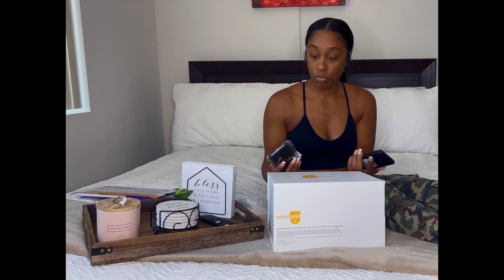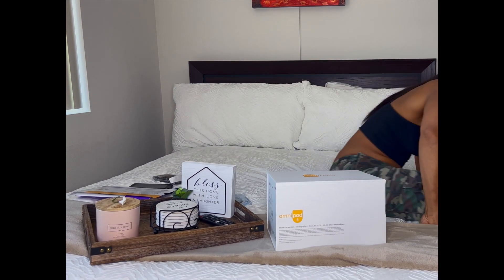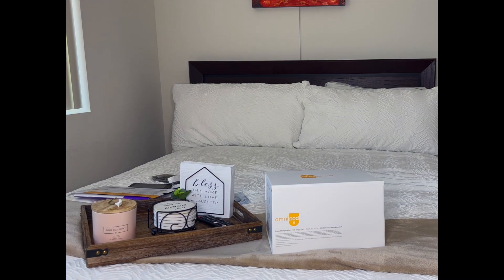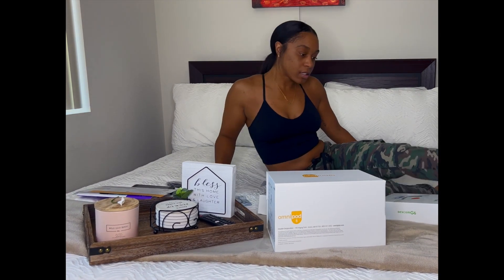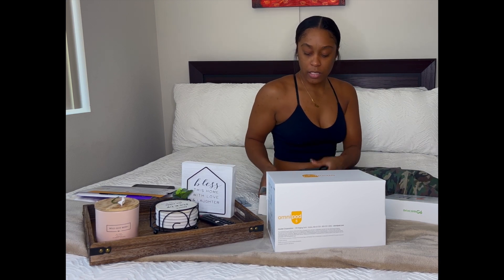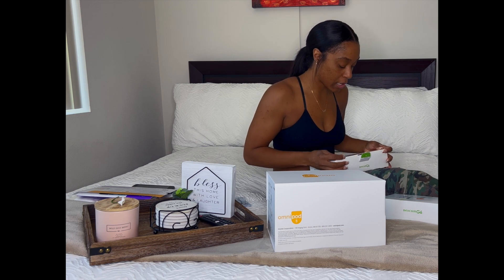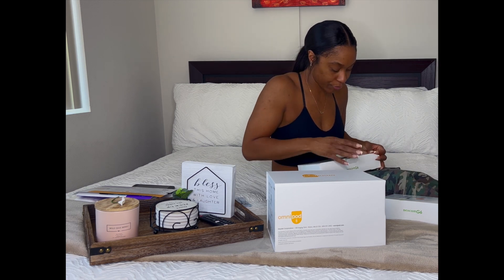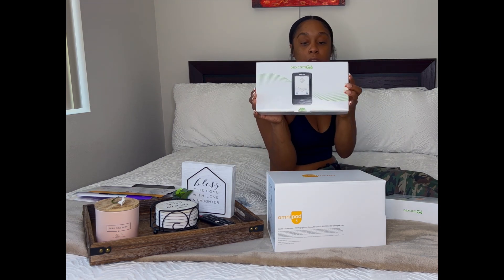Let's transition into what I want to show y'all next — I'm going to show y'all the G6. I recently switched insurances, so they sent me a brand new kit, which is great. This right here is the receiver.